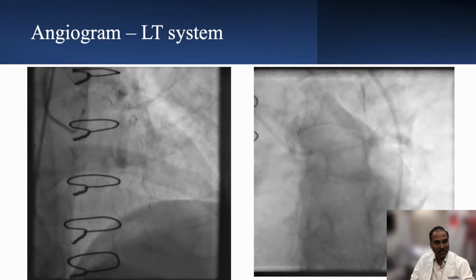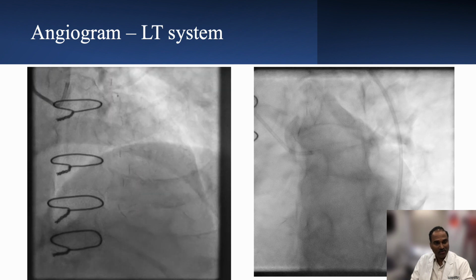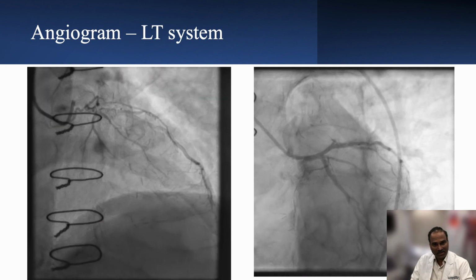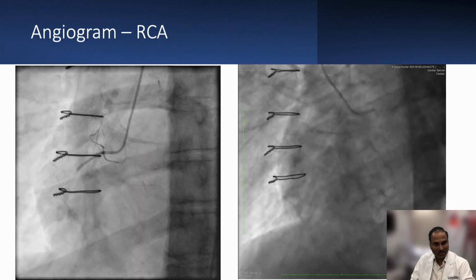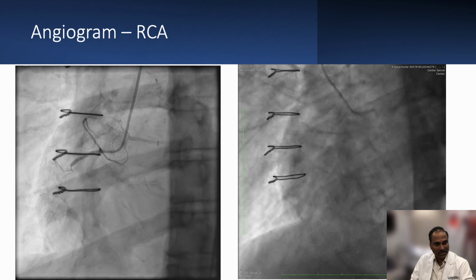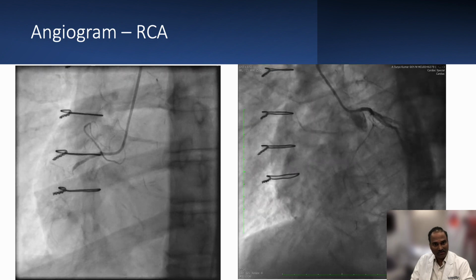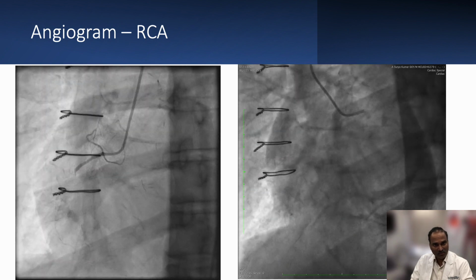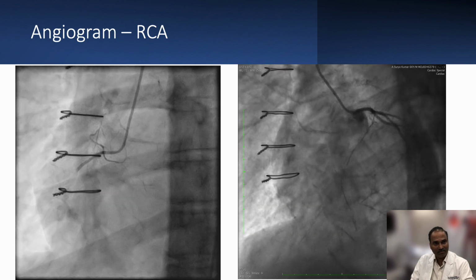This was the angiogram when he got admitted with non-QMI. You can see the native LAD CTO, and there was a lesion in the LCX, but it's pretty okay. And this was his native right coronary artery. You can see it's a total occlusion, and the right coronary artery is filling from the left system predominantly, and also from the LAD, which was filling from the SVG and LIMA.